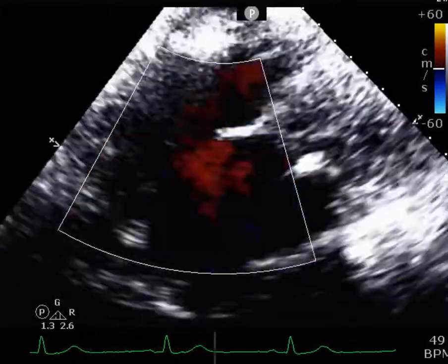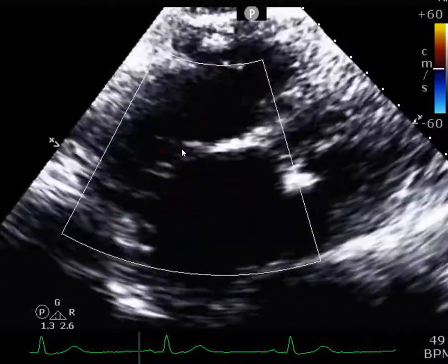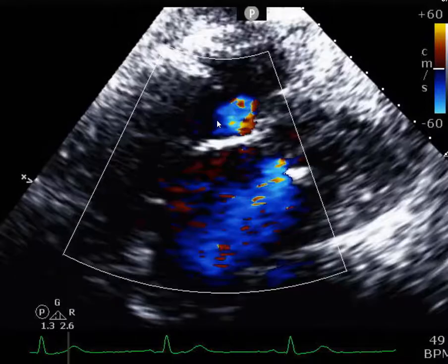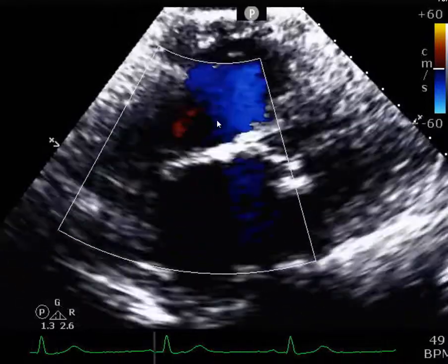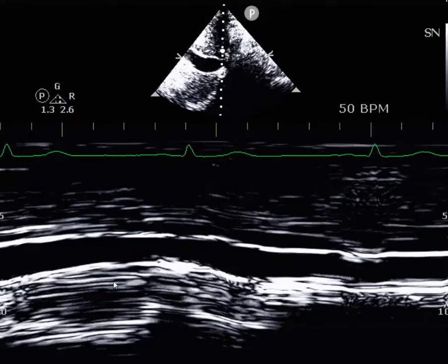And here is the subcostal view, and there's no PFO going from left to right, seen with echo with a color contrast. There's tricuspid regurgitation, which on this view actually looks pretty mild, but I believe it's probably pretty severe based on the previous views. Mitral regurgitation is likely underestimated on this view. The IVC is surprisingly not huge, 1.6, and it does look like it's collapsing, but less than 50%. So I would give this RAP about 8 millimeters of mercury.